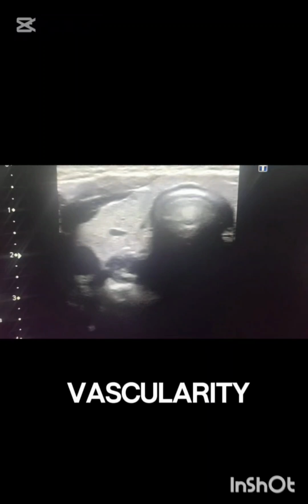Overall thyroid volume is within physiological limits, with no evidence of enlargement or atrophy. Color Doppler examination shows normal vascularity, with symmetric blood flow patterns in both lobes. No evidence of increased or decreased vascularity is observed. There is no intrathyroidal calcification, hemorrhage, or abnormal fluid collection.